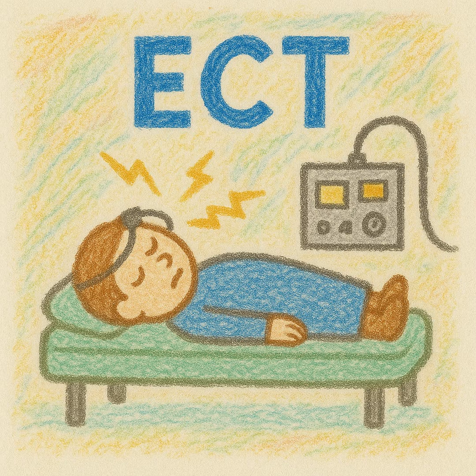The other thing, let's say you do have a 30-second seizure, which would be considered adequate. You're also going to be paying attention to a few qualitative markers of the seizure morphology. So you're looking at the tracing of the EEG, and you're going to be looking for the amplitude, how coherent each hemisphere is. Again, we're getting EEG tracings for typically both hemispheres of the brain. So we want to see that both hemispheres are lining up pretty well. We want to see good rhythmic, high amplitude activity. And then we're also looking for post-ictal suppression.